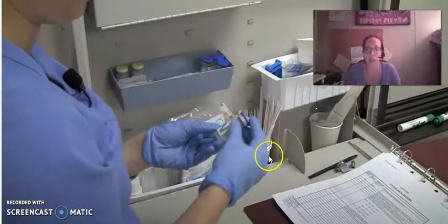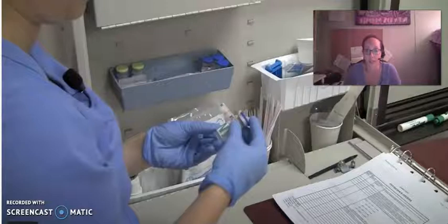You are going to perform hand hygiene, and then you're also going to don gloves because you're working with medications. There are two different types of insulin that we need here: NPH, which you know is cloudy, and regular insulin, which is clear. When you're mixing insulins, you draw the insulin clear before cloudy, which means you inject the air cloudy before clear. It gets a little confusing, but after watching it, it will make a little bit more sense.